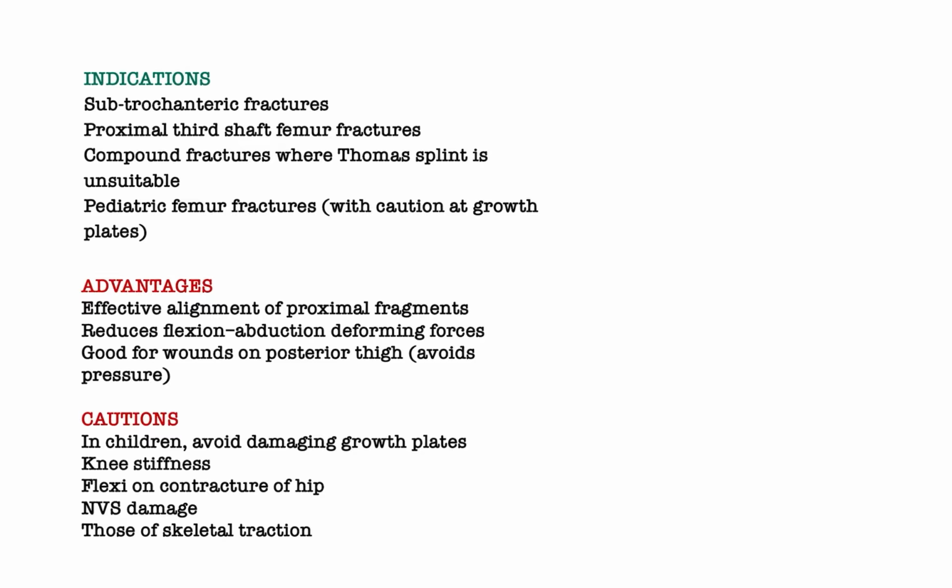The complications of 90-90 traction are that there is risk of growth plate damage, knee stiffness, flexion contracture of the hip, neurovascular damage, and all other risks of skeletal traction.